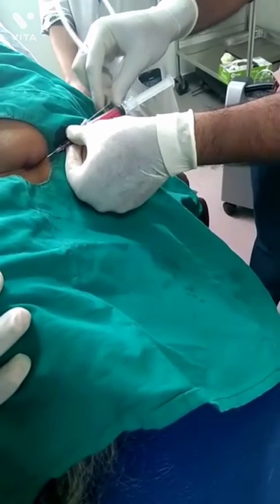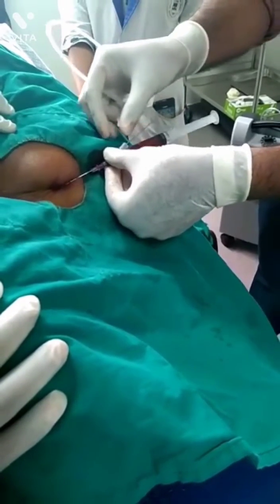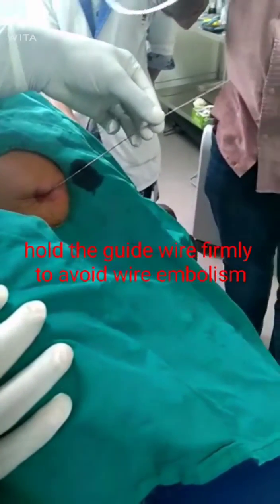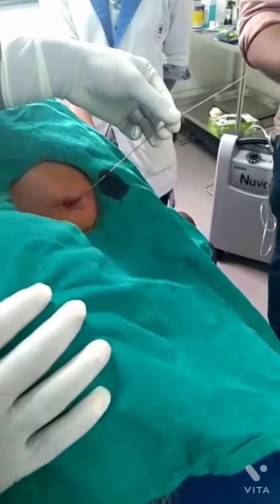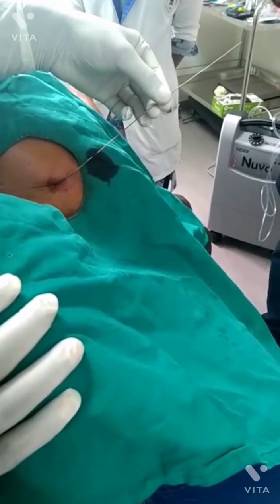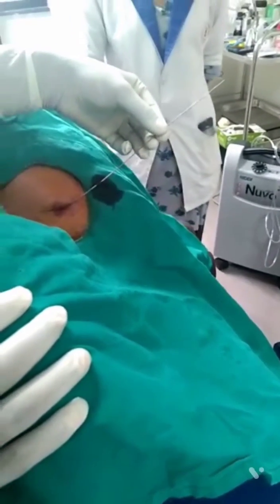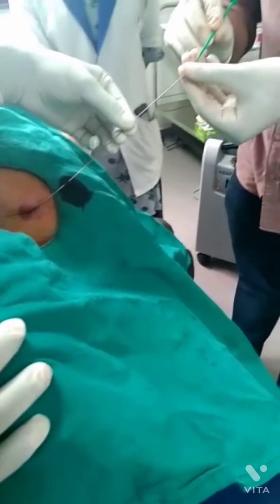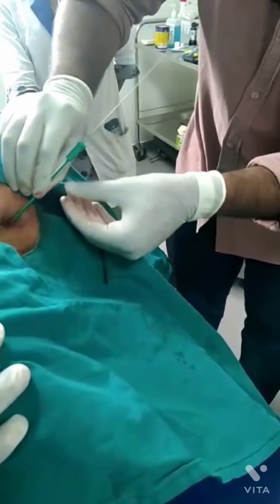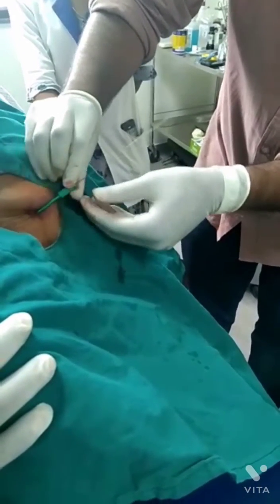You can see it. The dilator is being introduced. This is a dilator — you can get a little bit of the dilator in.